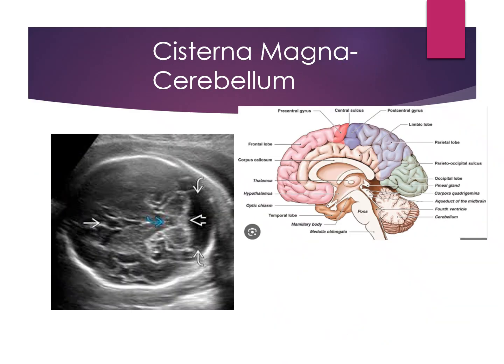Then we go into our cisterna magna and our cerebellum. They're buddies too. When I pointed it out, remember it hung out on that posterior aspect of the cerebellum. So that's where we're going to be looking. And if you see here, we have our circus peanut, I like to call it here, your cerebellum. And then posterior to that, you have this fluid collection. And this fluid collection is the cisterna magna. So circus peanut in the back, and then fluid, cisterna magna, and cerebellum.